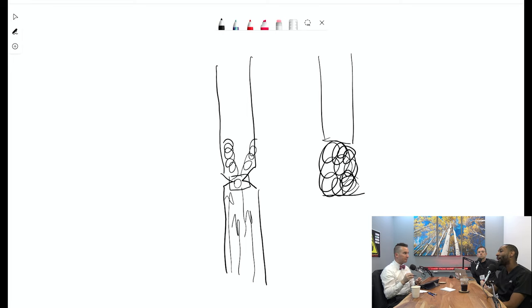So that's pretty much why contrast enhanced is still the best standard of practice when it comes to getting the carotids, huh? That's right. Because time of flight uses time of flight methodology and also the protons not being too out of phase. That's the basis of the sequence. Whereas contrast enhanced uses just T1 shortening. And so it doesn't matter. That's the reason why in MRI, the gold standard for stenosis is going to be contrast enhanced angiography.